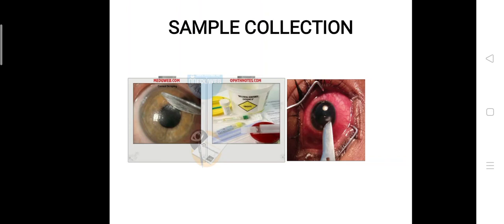In order to have the best possible chance of providing the clinician with an accurate diagnosis, any of these media is required. In some remote settings, some media may not be available, or there may be limitation in the variety of media, so it might not be possible to process. For this situation, you have to use Sabouraud glucose agar plate, and the liquid phase media broth which can be used is the BHI, and it is essential to inoculate in more than one bottle.